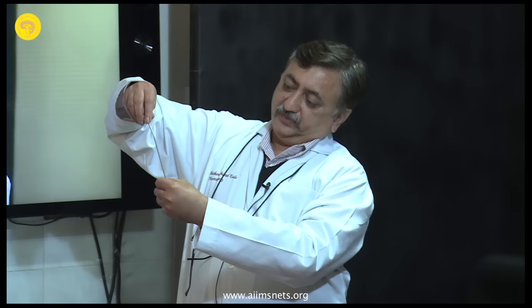So that's the dangerous technique, because the thoracic pedicle is not big. So if you go straight down and your entry point is wrong, you'll end up in the canal. So there's another way to do it. The in-out-in technique. You don't go to the medial wall at all. If you see, this is the pedicle, right? This is the transverse process, and this is the body. So you can start more laterally. You can start at the top of the transverse process. Go straight down, you'll remain outside the spinal canal.